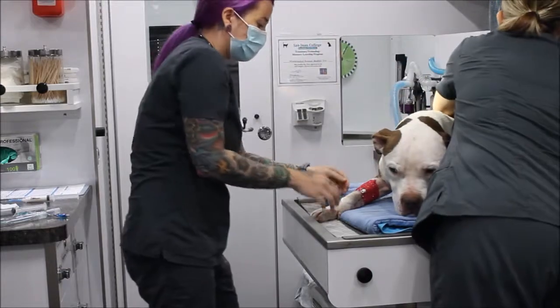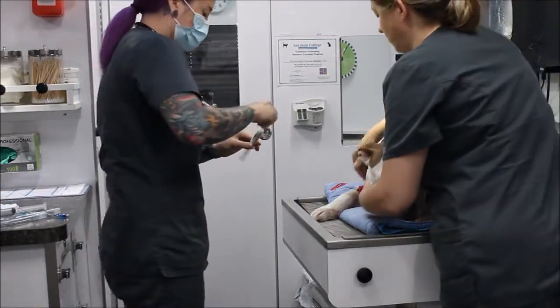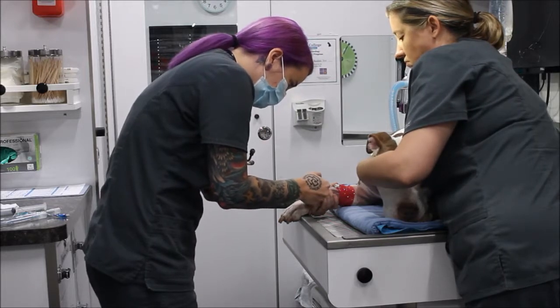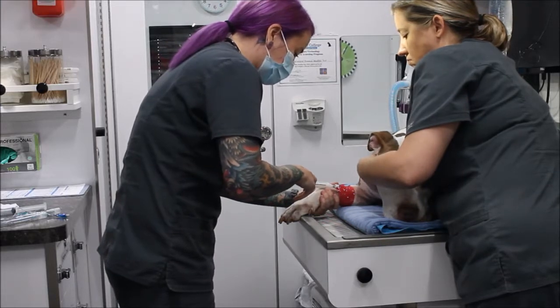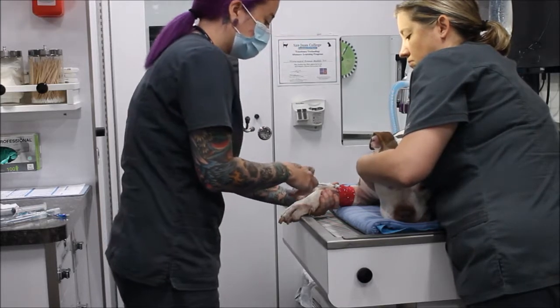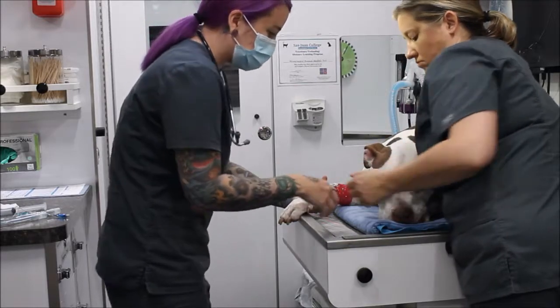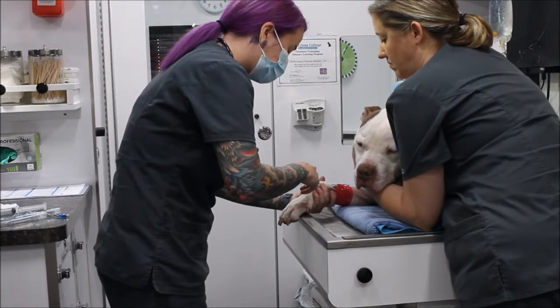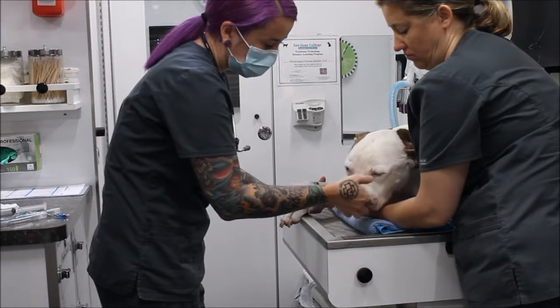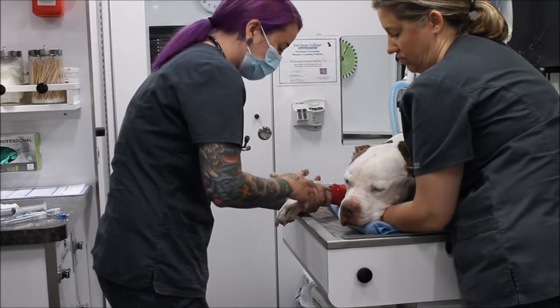Now we're ready to give him his induction agent. My assistant is going to hold him. I'm putting it in his catheter and giving it very slowly — about a quarter to a half at a time. I don't want to give it too slowly; we want to get him through the second stage of anesthesia, which is the excitatory phase. We also don't want to give it too fast because it can cause apnea, so I'm giving a little more at a time.